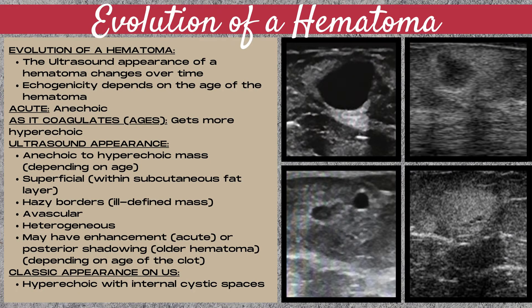Most commonly when we visualize hematomas, we will see a mass that has both a hyperechoic component and a cystic component. The ultrasound appearance of a hematoma is going to be anechoic to hyperechoic, depending on the age.